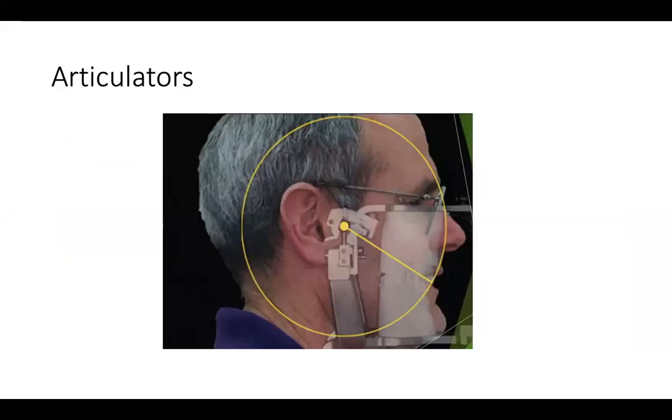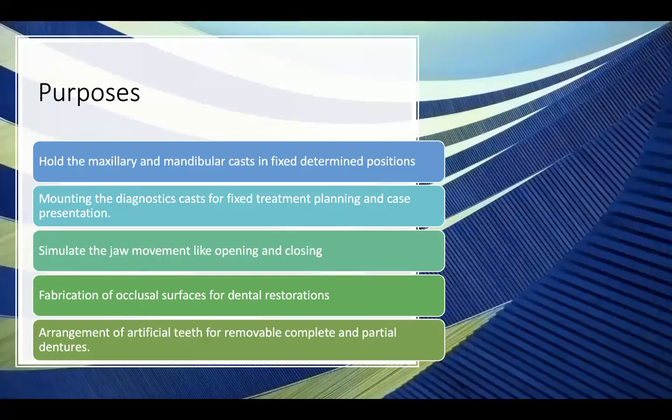Okay. So when we refer to the same relationship and we want to replicate the motion of the mandible, we have to rely on an instrument like an articulator, in which this yellow portion is in fact depicting the condylar element, or the condylar head, which is being replicated within the articulator, right? So we need to understand that the condylar part is showing how the TMJ functions and how it is utilized during movement of the mandible.